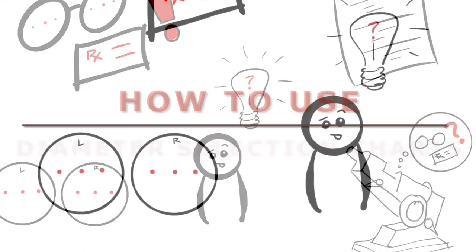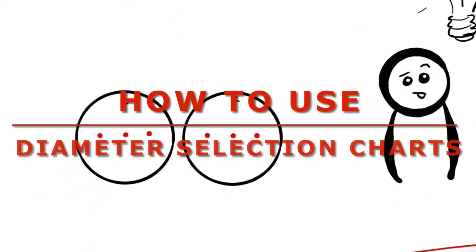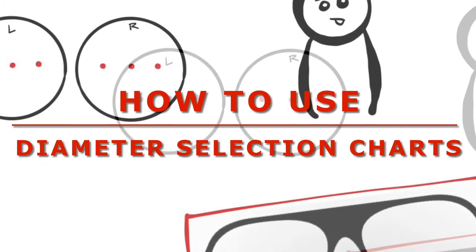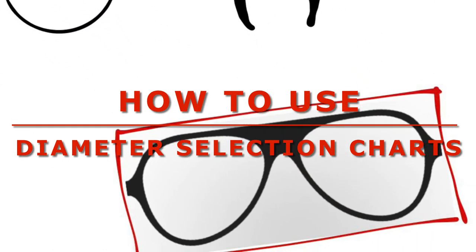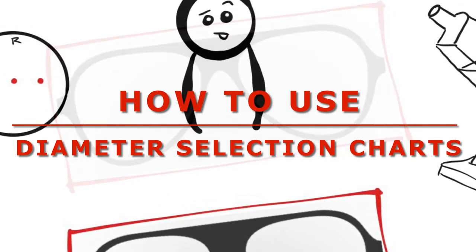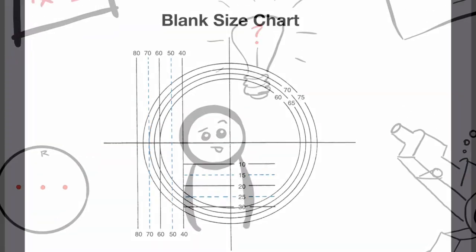In this video, I'll show you how to use a blank selection chart to determine lens blank size. These charts are useful and provide fast and accurate results that account for both horizontal and vertical decentration.